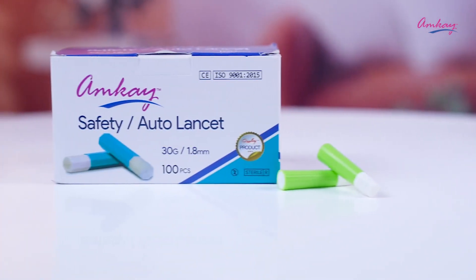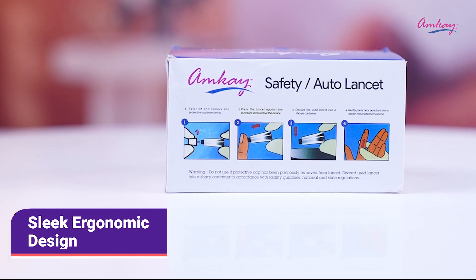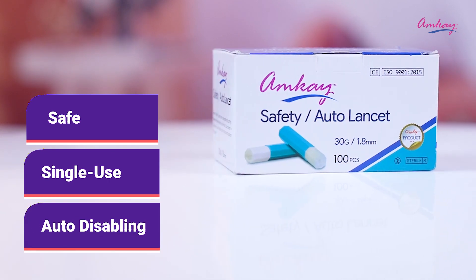These lancets are made with best quality with a sleek ergonomic design. Each lancet is safe, single use, and auto disabling.